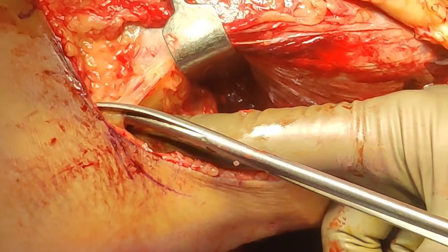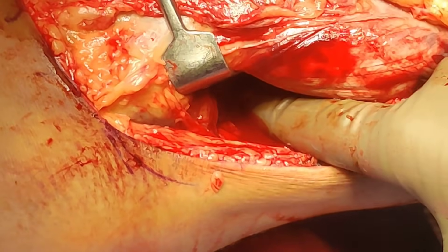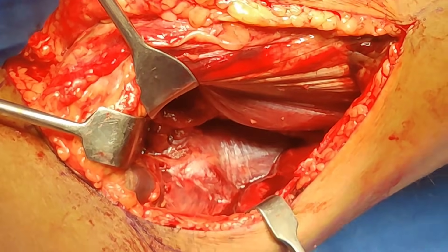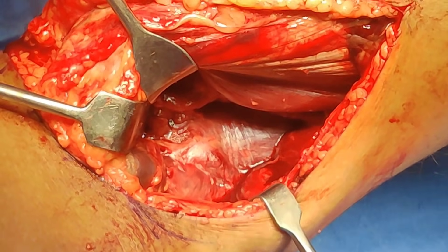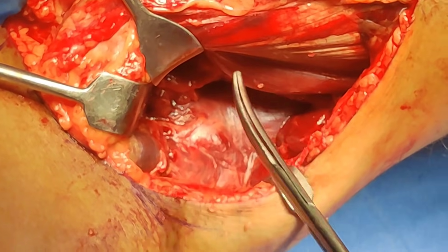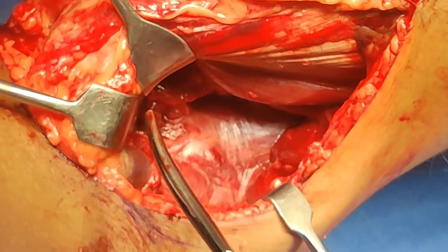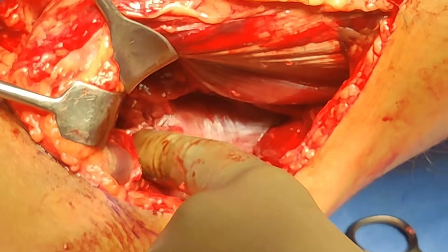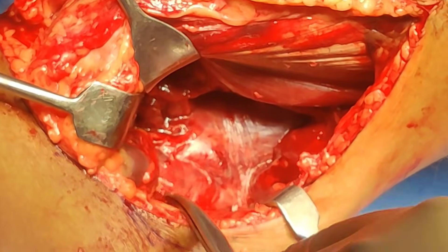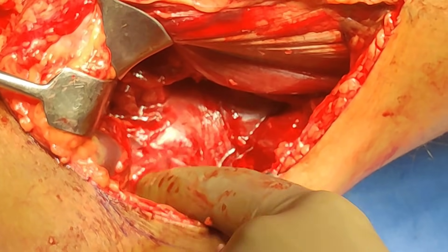I'm just releasing it and we will start seeing the proximal part. So far I've done nothing more than: skin, subcutaneous tissue, opened the fascia. I'm bending the knee because it takes the tension off the gastroc so I can show you better. Now Amit and Nikunj are reflecting the gastro-soleus complex up, and now if you see here — we are on the back of the tibia. I can feel the fracture — this is the fracture site. This is the popliteus and this is the soleus. Once you reflect this up, you will be right onto the bone.